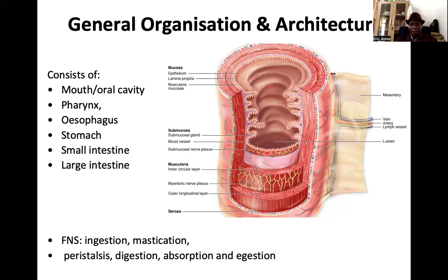So you can see the nerve plexuses, and the nerve plexuses are there because they need to innervate some muscles. Okay, so there are smooth muscles within the gut, and when we take the esophagus, as we see later on, it even has some skeletal muscles at some point.